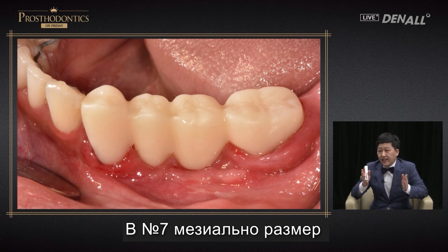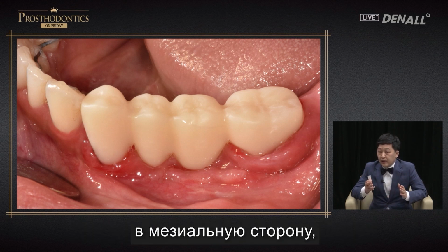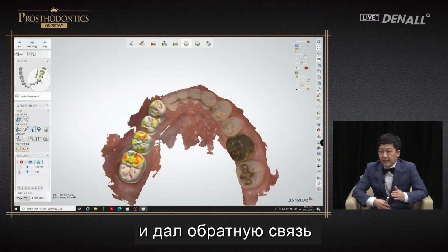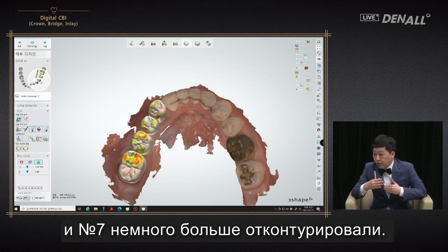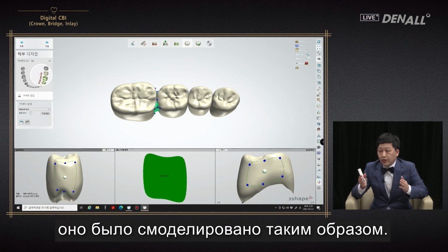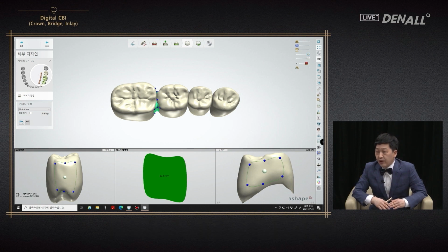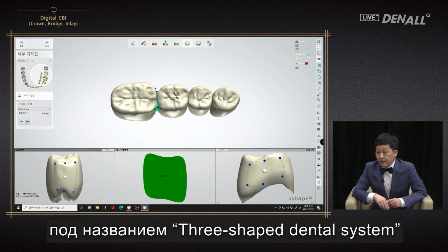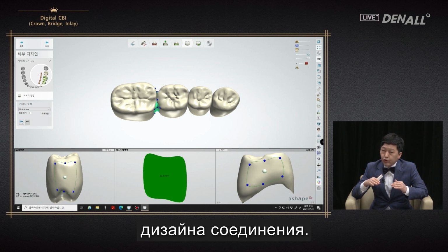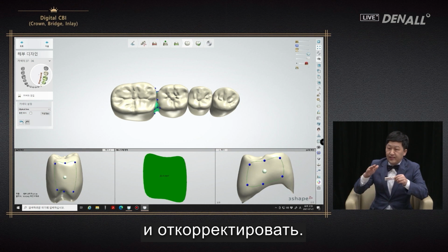In number 7, mesially, the size was too big, and number 6, it was slightly tilted towards mesial side. So I looked at how the crown was designed and provided feedback. And number 7 was slightly more over contoured. If you look at the joint was designed like this. It was too inferior. Fortunately, the design program called the 3-Shape Dental System allows for easy reforming of joint design. Adjustments can be made easily. Corrections can be made easy.